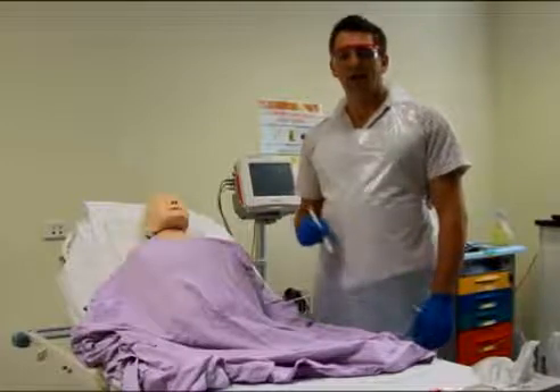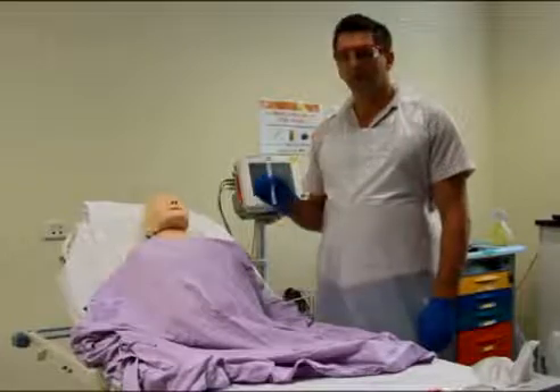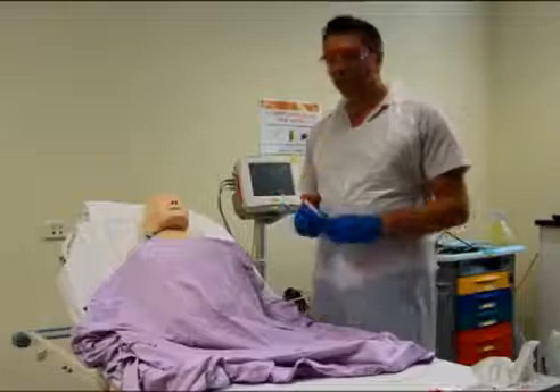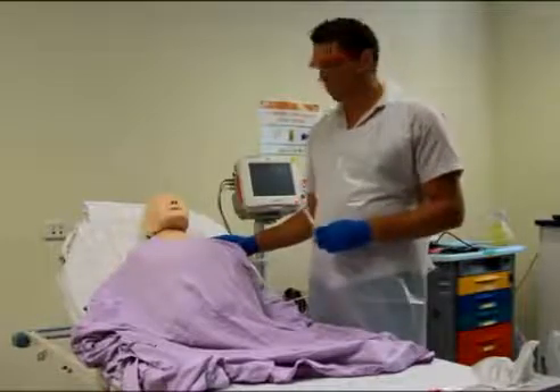Welcome to today's episode of Nurse on the Go video. Today we're going to talk about taking a nasopharyngeal swab. It is called an invasive procedure, a bit uncomfortable for the patient, so always explain what you're doing.